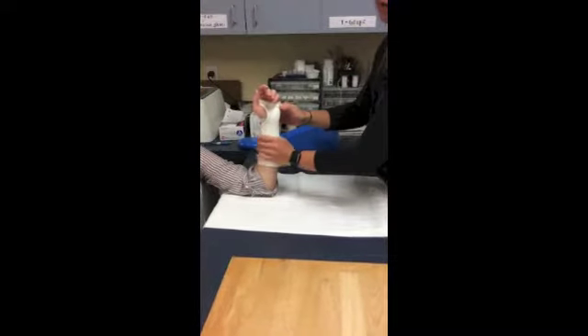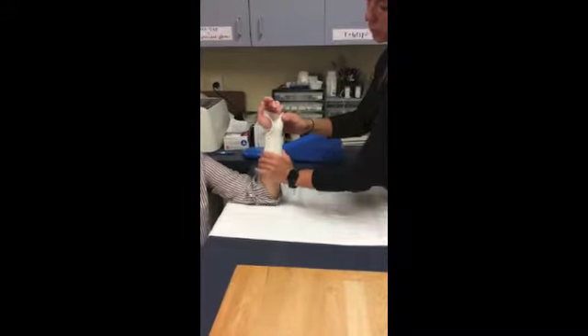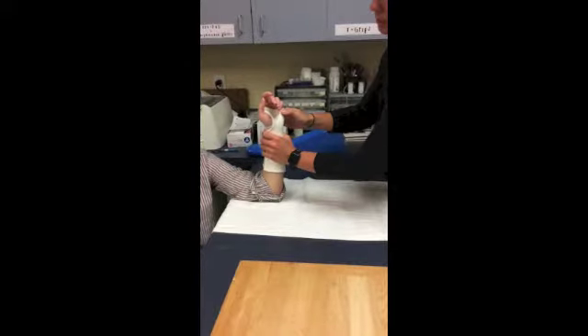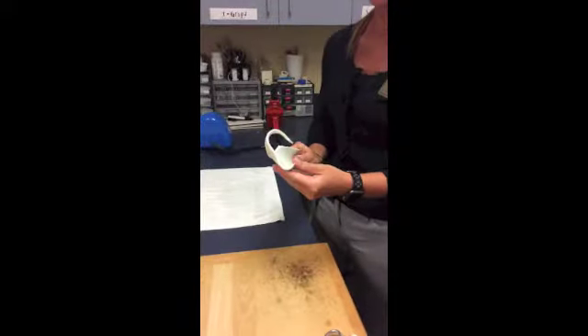Now allow time for the orthosis to harden. Make sure you're smoothing down the forearm so you're not getting any fingerprints, and make sure to keep that wrist in slight extension. Now that it's hardened, I can take it off the patient and smooth around the edges or cut any excess that I need to. You can also dip it in the hot water and smooth around the edges too.